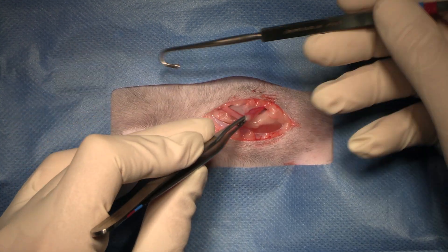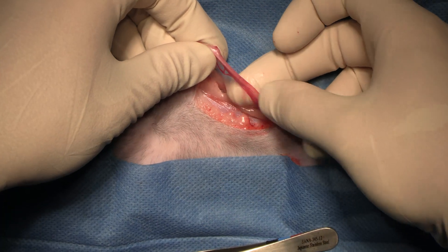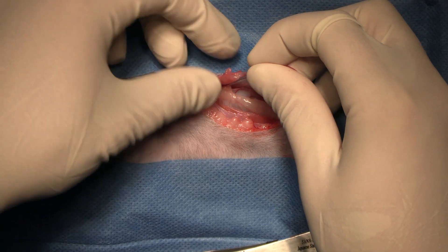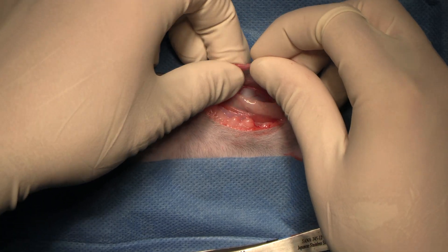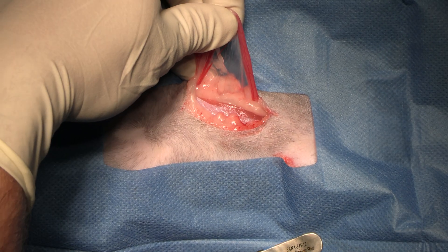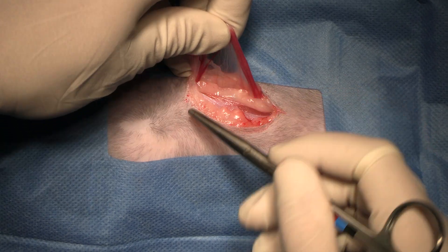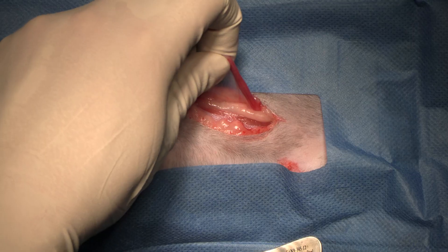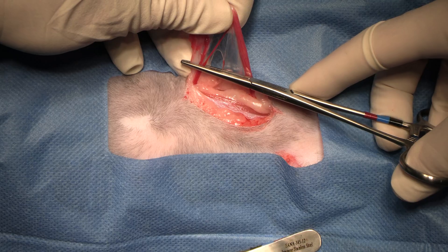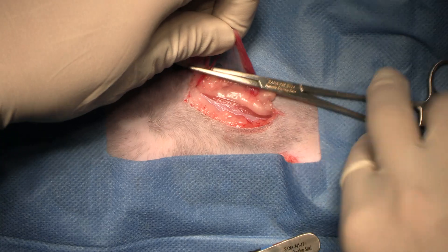We've got it. Uterine horn, uterine artery running along it, ovary. We've got our ovarian duct on top, so it's in the right orientation. I can fan out the ovary and see the anatomy — ovarian artery, suspensory ligament. We've got enough room, so I'm not going to do anything to improve my exposure. I'm just going to go ahead, hold in the broad ligament, and put on our single hemostat.